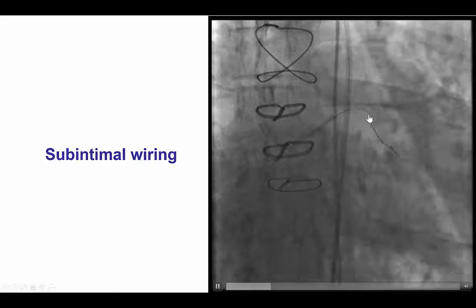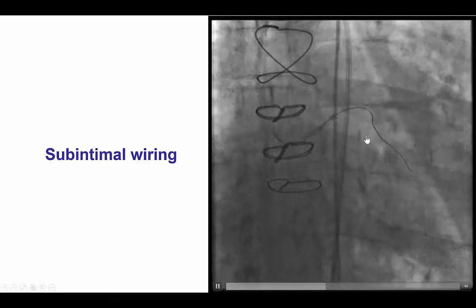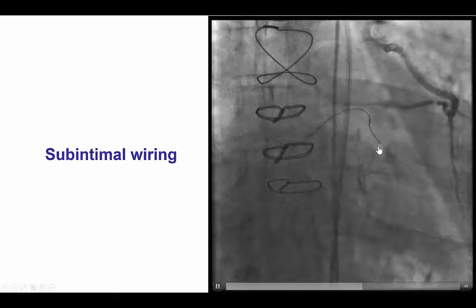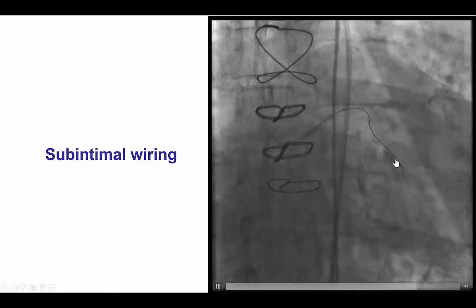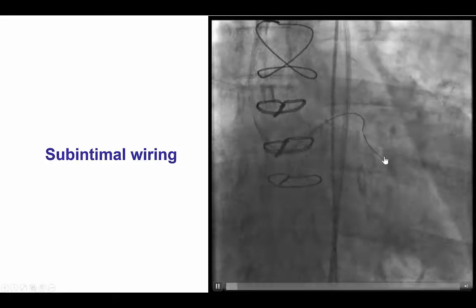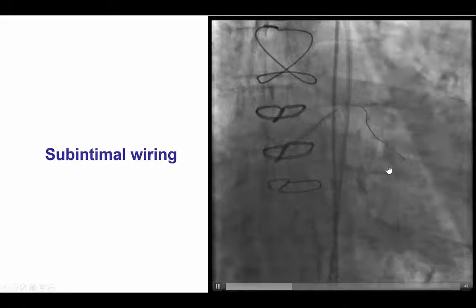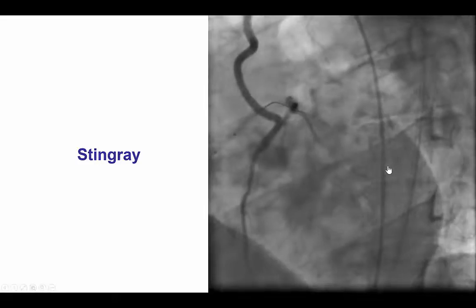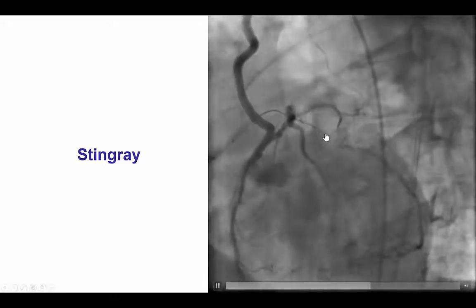Indeed, we were able to advance the guide wire further down using several microcatheters like the Caravel, as well as the Pilot 200 guide wire. We now had the guide wire tracking in sync with the large obtuse marginal branch. However, we were in a subintimal location, and therefore we needed to perform re-entry.